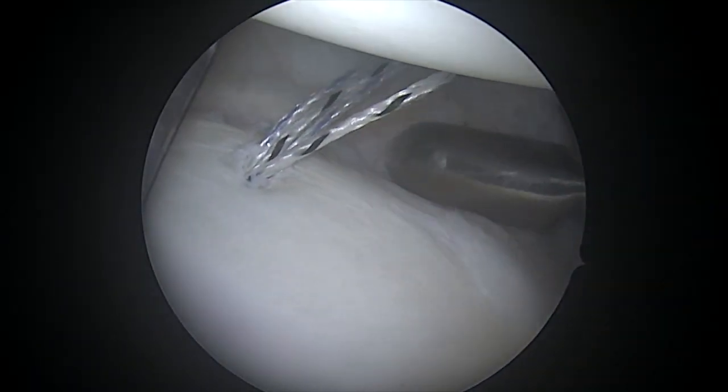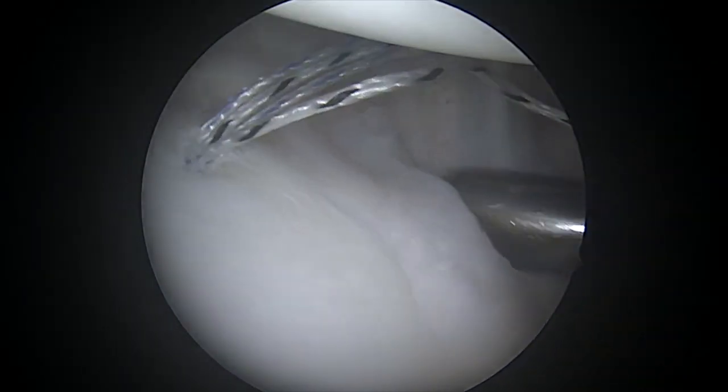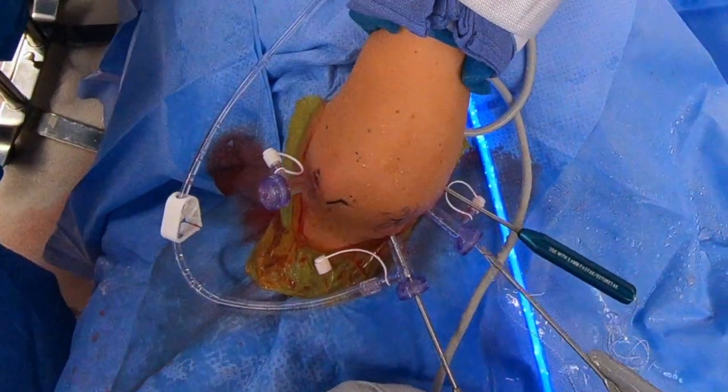This is to excite the synoviocytes, to encourage them to heal to one another, to make that loose capsule tighten itself down.